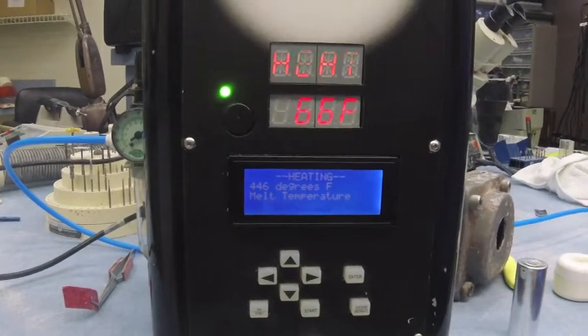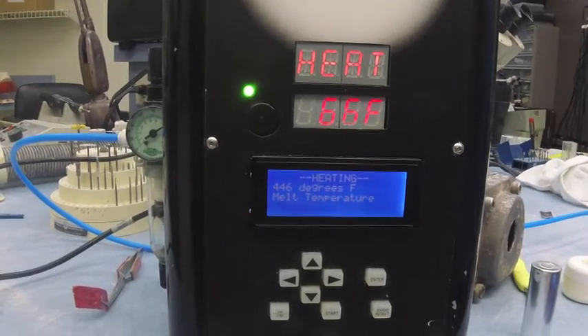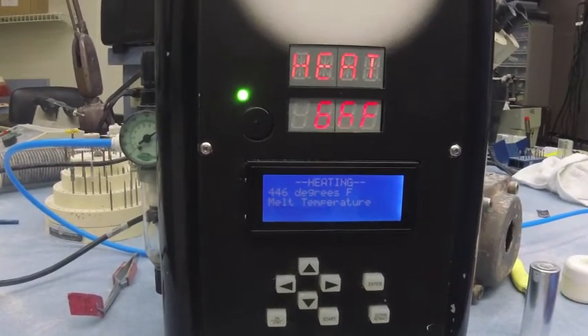At that point, hit start. You can see it says heating. The fan will kick on to keep the electronics cool, and what it's doing at this point is getting the machine ready.